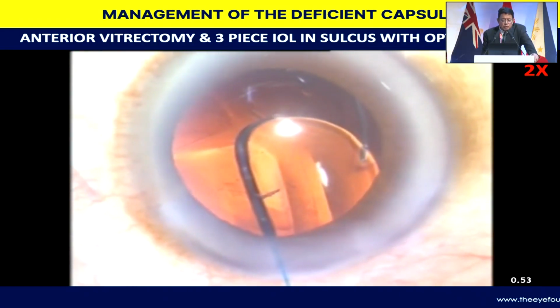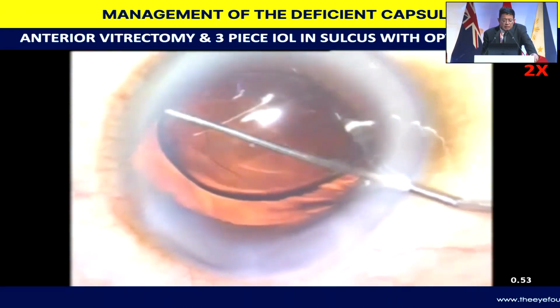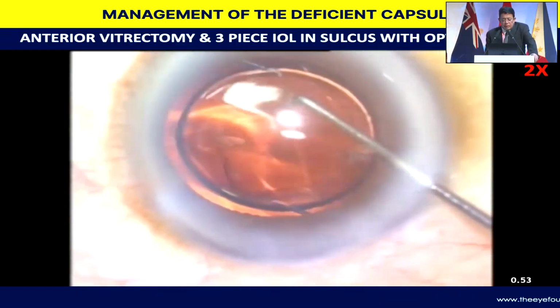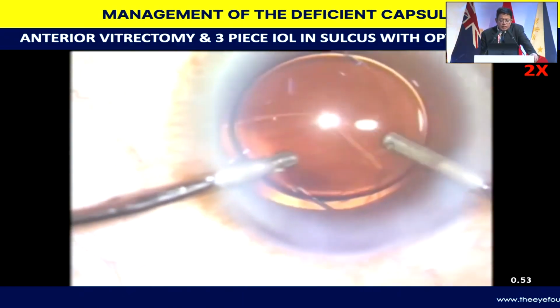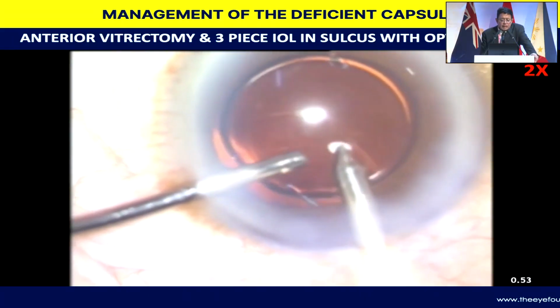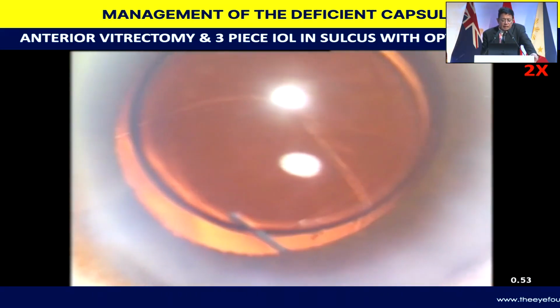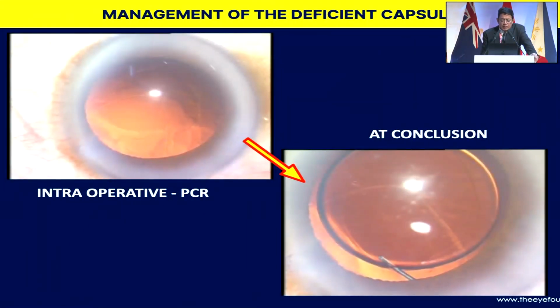That's a 3-piece lens going into the sulcus. At that time, we did not have the concept of capsular capture that Dr. Chang talked about. So basically, I'm placing it in the sulcus there and then creating an adequate rhexis capture. It's essentially an optic capture that I'm doing. And whatever little strands of vitreous are there are again being taken care of. You can see the fairly large tear over there, but that's the end of surgery. And this is what the patient had on the table, and this is what we ended up with at the conclusion of the surgery. And mind you, this was done about 25 years back.